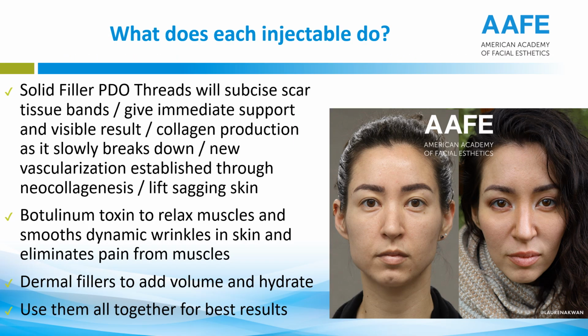So let's take a look. What does each injectable do here? Solid filler PDO threads, there are 2 kinds. There's smooth and there's lifting. We're going to show you both here, and we're going to talk about all the different brands and why AFI Techniques and the brand that we use, VSoft Lift, is so much different than anything else out there. I'm going to show you everything that some of the different brands show you, and you decide.